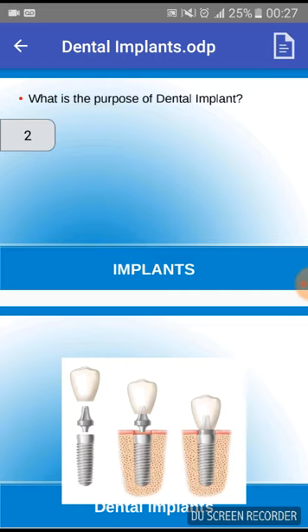So what can happen is that if an implant is placed abnormally, resulting in a large amount of force being placed on the implant, this can cause it to fail as well, because remember the forces have to be dispersed correctly. But if you have force being applied to one specific area incorrectly, that can cause the implant to fail.